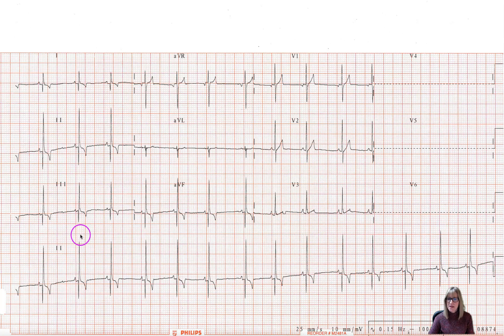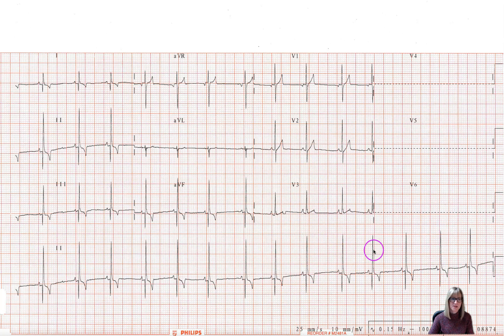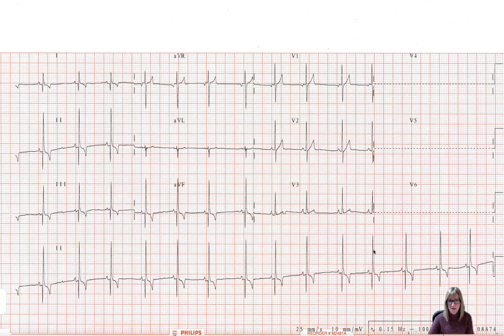And then on the bottom, the fourth line, we have a lead two rhythm strip all the way across. That's fairly conventional for a lot of machines to produce a multi-lead layout that looks quite a bit like this.